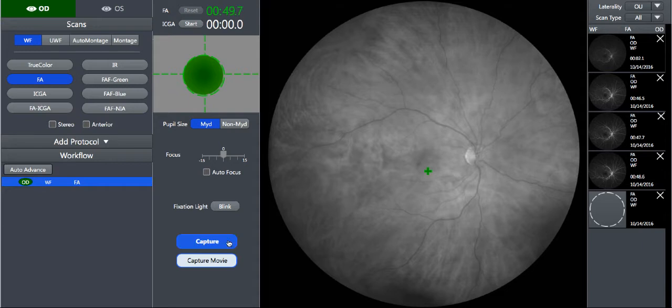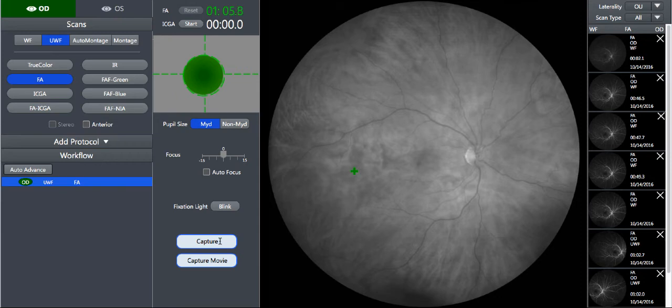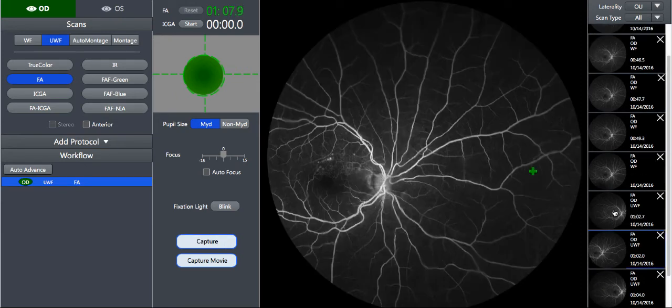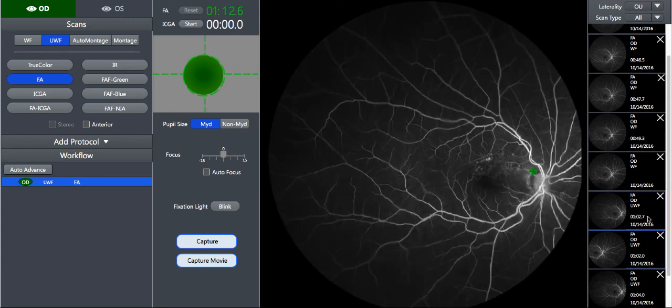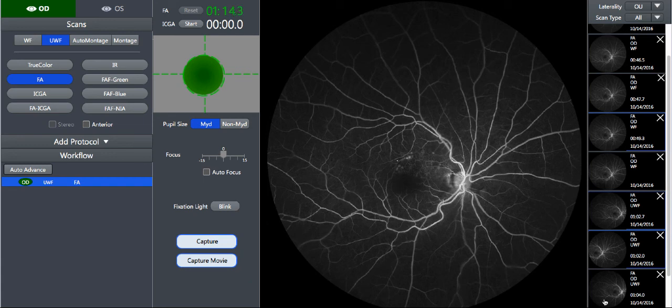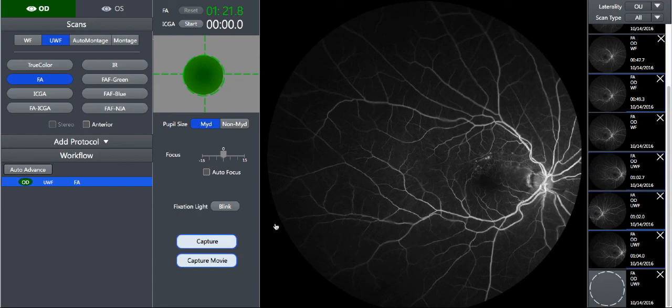After acquiring a couple more wide field images, I want to switch to an ultra-wide field view. The ultra-wide field capture requires stitching together of 2 images with preset fixation points, so the prototype automatically moves the fixation to the correct location with each subsequent capture. As you can see, the images that are populating the bin are accurate in terms of fixation and timestamp, which was crucial in avoiding the distractions that can be caused by inaccurate placeholder images and system behaviors during demonstrations with end users.